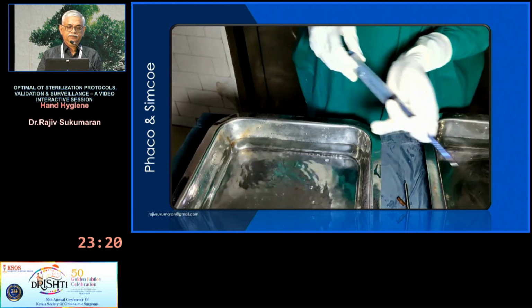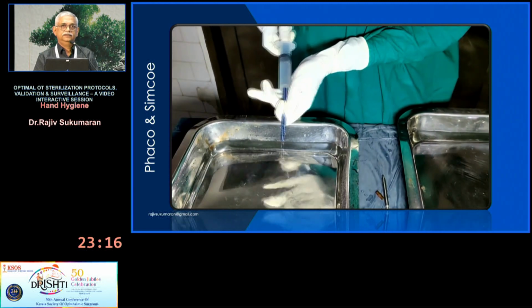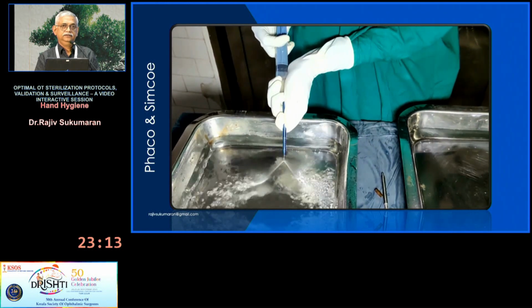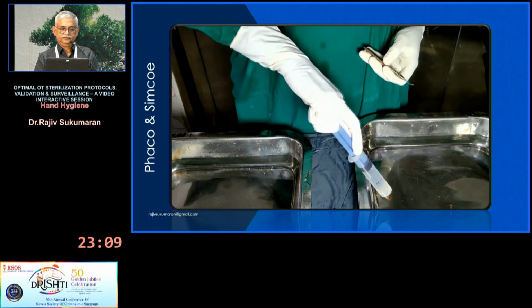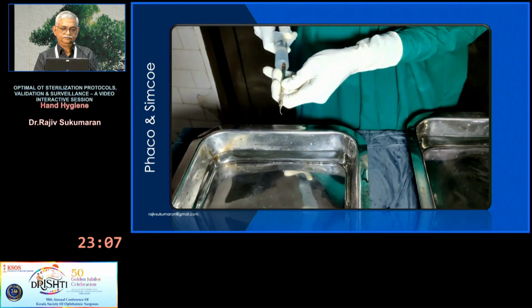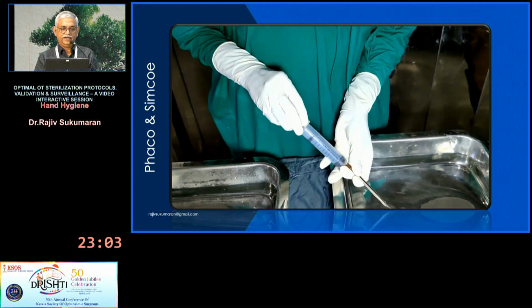For aspiration, you aspirate the cannula instead of pushing. Normally we do this, which is wrong actually, you have to aspirate only.